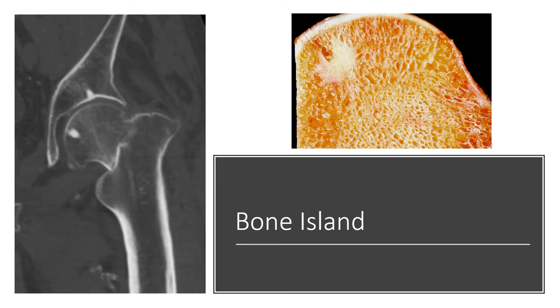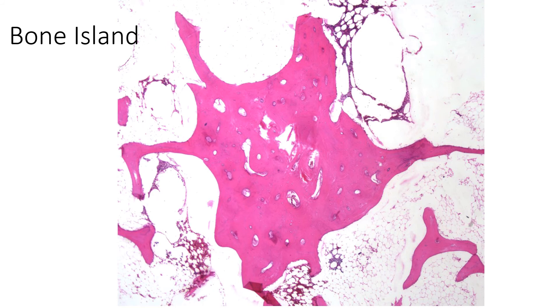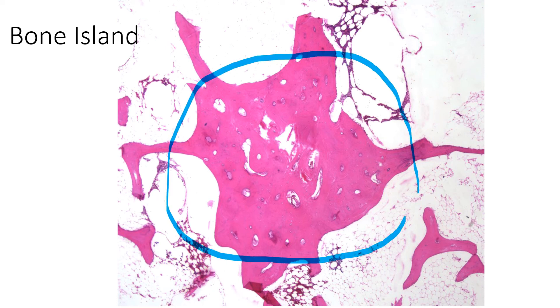Here's a bone island — notice it is within the medullary cavity, with the same density as the overlying cortical bone. Here's actually two bone islands in the same specimen — dense intramedullary lesions. On the gross specimen from the femur you can see it looks like dense cortical bone sitting in the middle of cancellous bone, and it seems to create little tentacles that extend into the adjacent cancellous bone. The histology similarly shows mature cortical-like bone in the middle of cancellous bone, throwing off these characteristic tentacles.